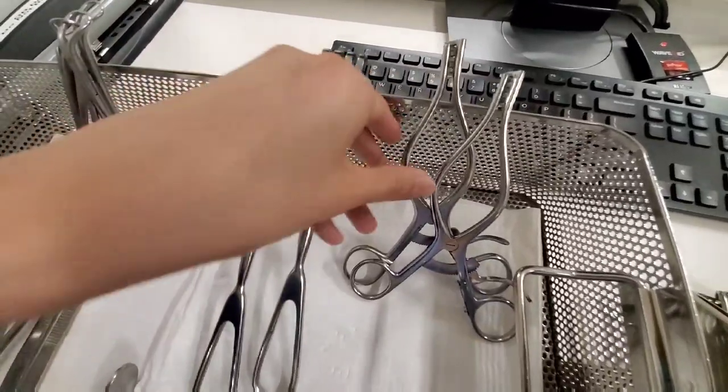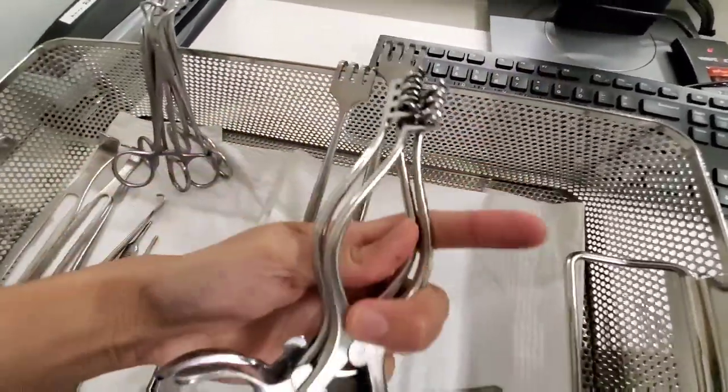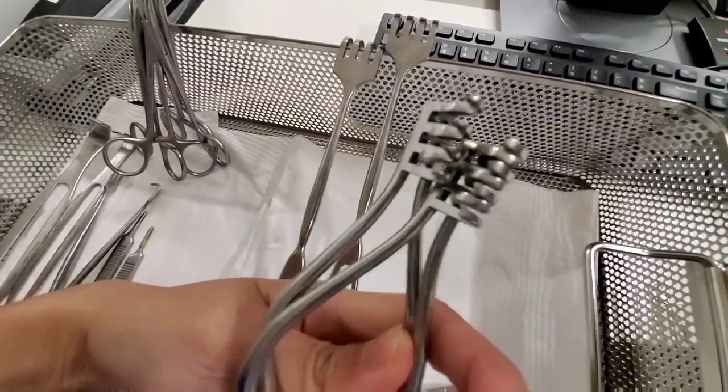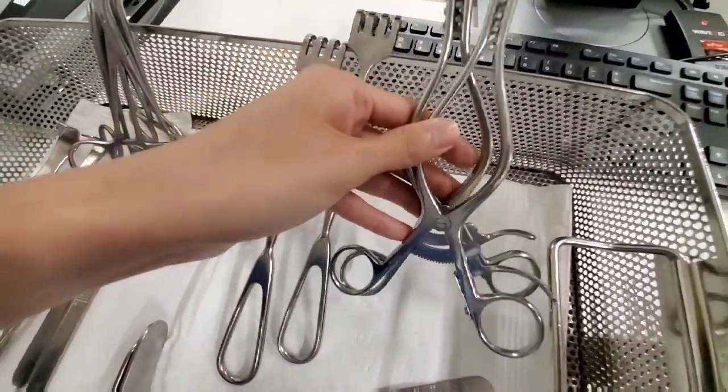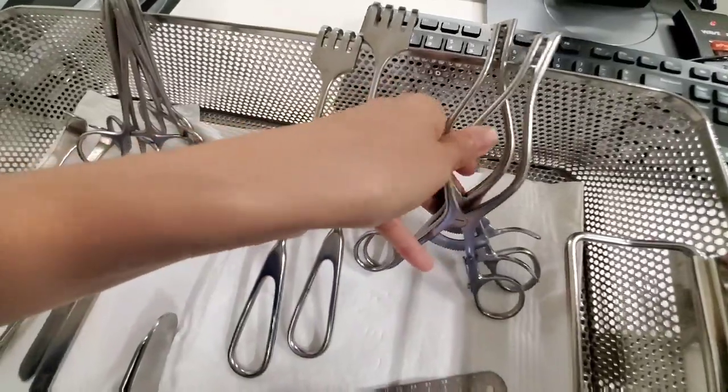These are called sharp Weitlaner retractors — sharp and dull. When you're giving these out to a surgeon, if they ask for a Weitlaner, make sure you ask whether they want sharp or dull.